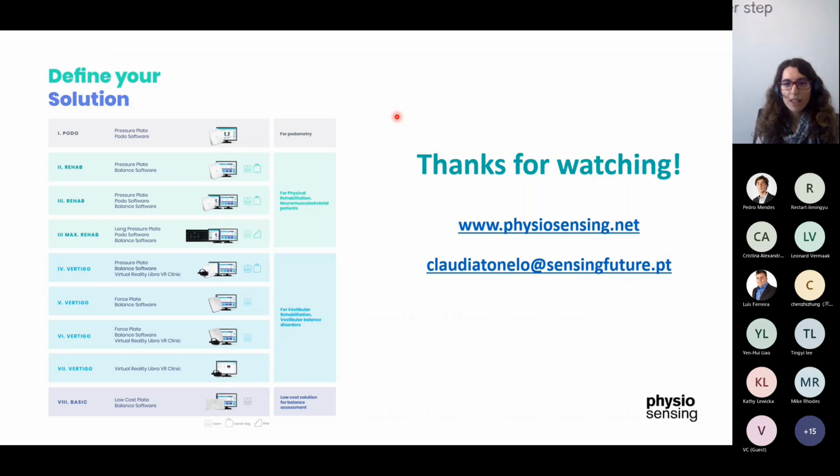So we have right now 4 types of platforms, pressure and force platforms, and we work mainly in 3 areas: podometry, physical rehabilitation, and vestibular rehabilitation.